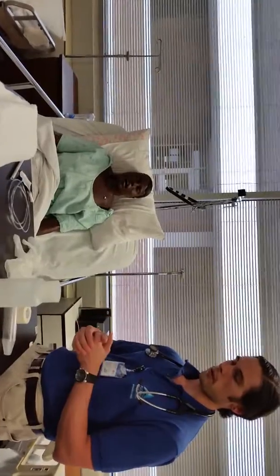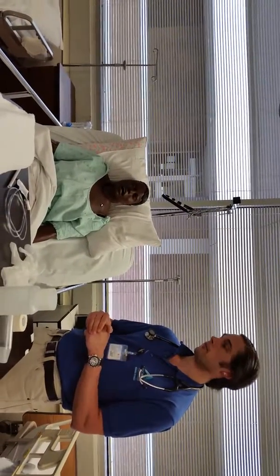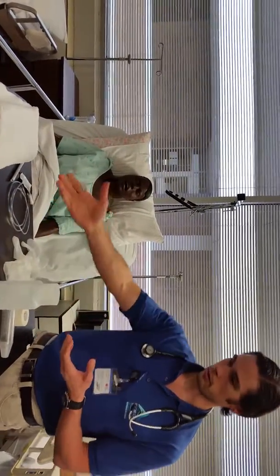So first I would check the MAR and make sure what type of NG tube the doctor wanted and the purpose of it, what the NG tube was for. I'm going to make sure when I come in the room, the patient will be in high Fowler's. I'll have all my equipment. I've got my NG tube, towels, syringes, pre-ripped tape.